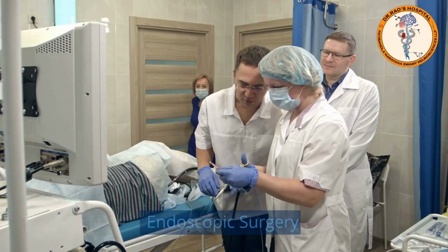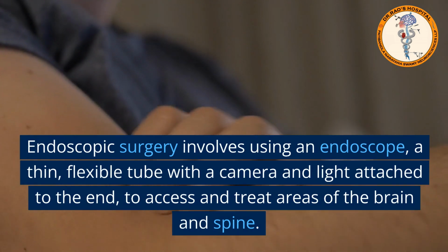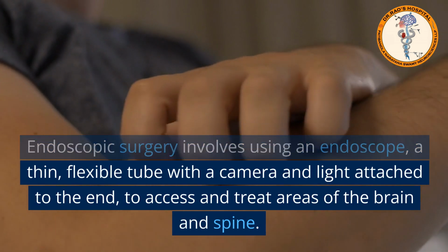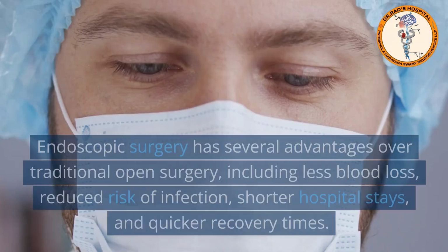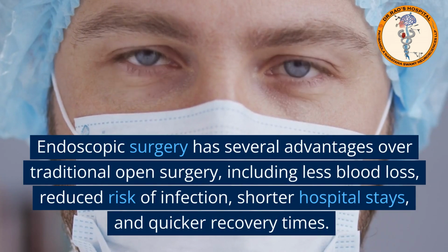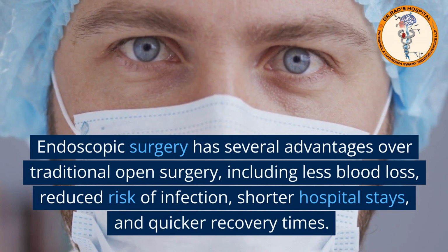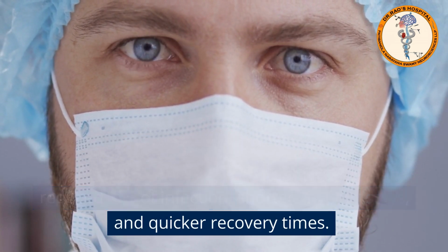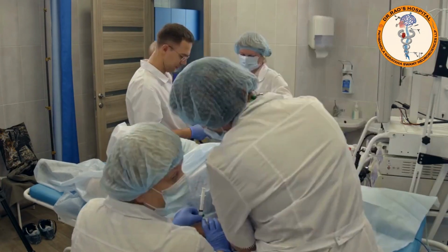Endoscopic surgery. Endoscopic surgery involves using an endoscope, a thin, flexible tube with a camera and light attached to the end, to access and treat areas of the brain and spine. Endoscopic surgery has several advantages over traditional open surgery, including less blood loss, reduced risk of infection, shorter hospital stays, and quicker recovery times. Endoscopic third ventriculostomy.